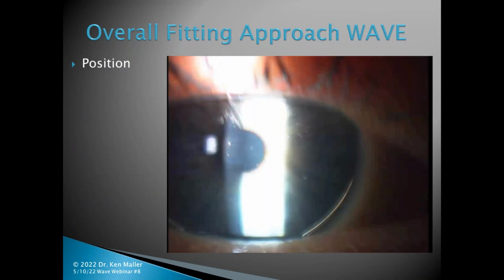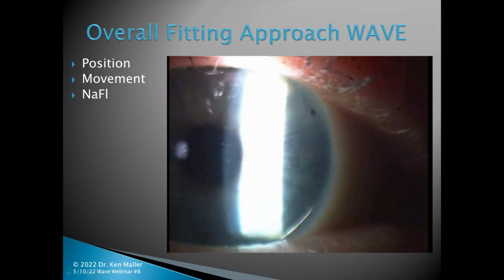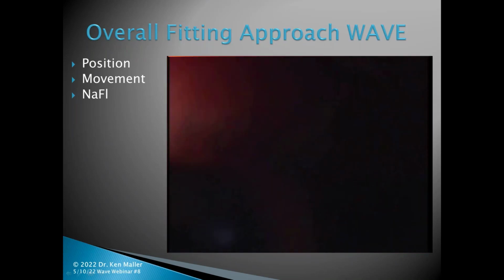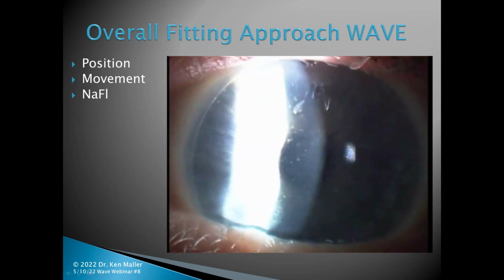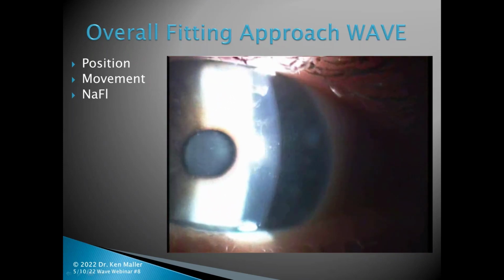This was actually a case I had done through consult. So this is not my video, so I apologize for the movement of the video, but let's take a look at the video. And this is a WAVE lens that I designed for this particular doctor. I want you to take notice of the position of the lens, the movement of the lens, and in just a moment we're going to see the fluorescein pattern. So I want you to take a little time to assess that fluorescein pattern and see what you think.